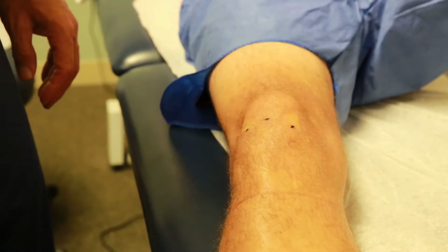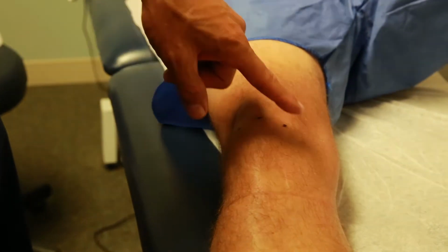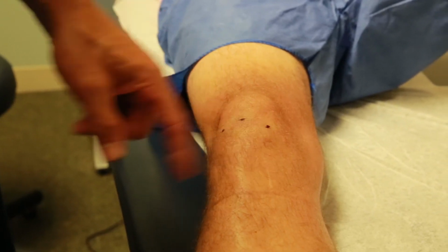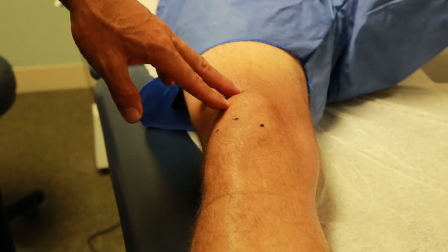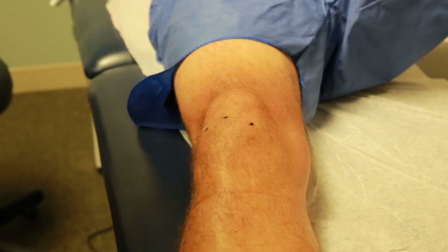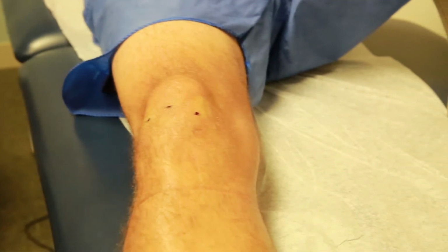Now the interesting thing here is when we go from these poke holes, we're going to be able to see all sides of the knee. If I come here, I'll get a good shot of the medial side, the ACL, and then the lateral side. If I go from the medial aspect, I can see the same thing, but I see the ACL origin a little bit better. We tend to like to go lateral just because that's what we're used to doing in the operating room.